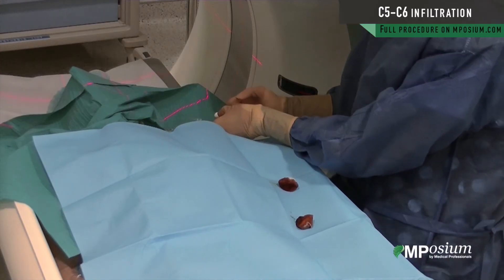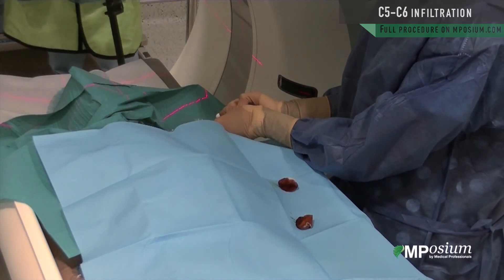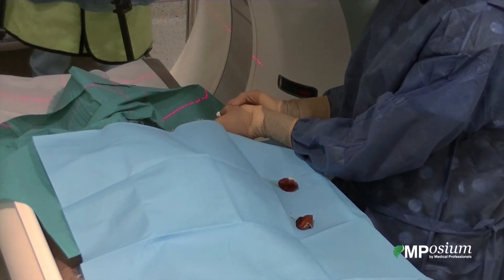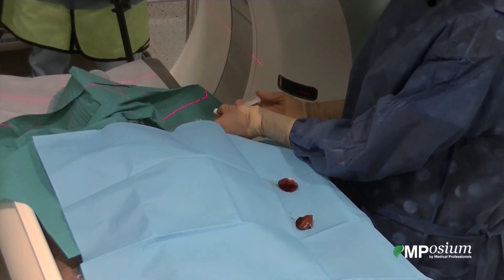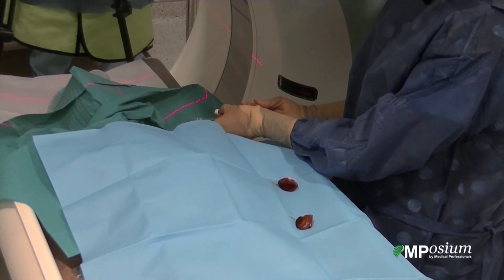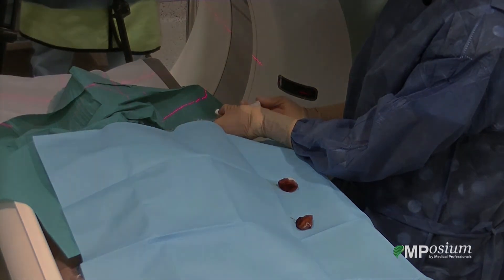The patient is saying that she has her pain — that the injection of the medication is provoking her normal pain — which is a good sign that we are injecting in the correct foramen.